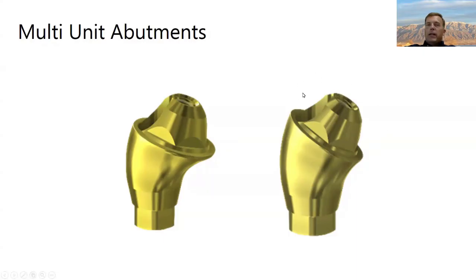You'll find more and more companies are developing what they call a universal MUA, which is one that is honestly similar to a Nobel MUA. If it has a universal interface, it's going to give you the ability to do any of the digital workflows we're going to talk about. If you have an implant system that uses a proprietary MUA shape, it will limit your workflows. So not only would I recommend using MUAs, but I would say you could make your life easier by using universal MUAs.